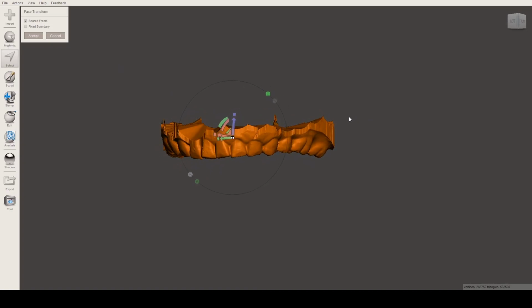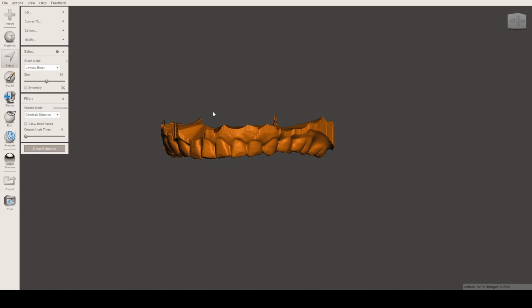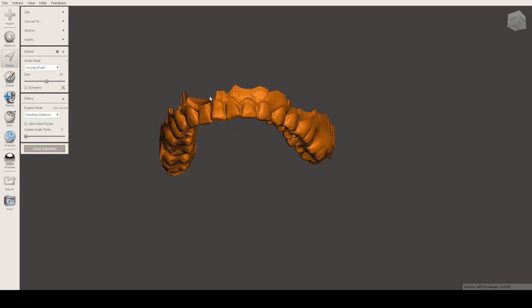So that's how you can transform it. Just play around with it. Don't be afraid to play with your model, because if you don't read the manual, then the more you make mistakes, the more you learn actually. So that's transform for you. Just click accept, and then it will render the model once more, so you have to wait again. I'll skip to the waiting part actually. Okay, no, it's already done.